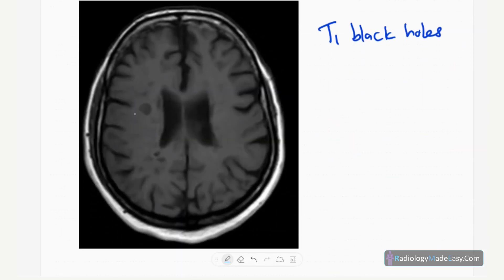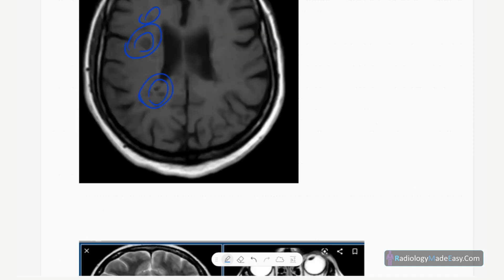Another feature you can see on T1 images is low signal rounded lesions — we call these T1 black holes. These are also seen in the periventricular deep white matter.